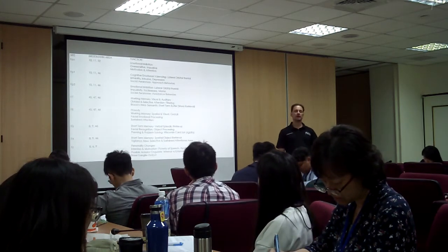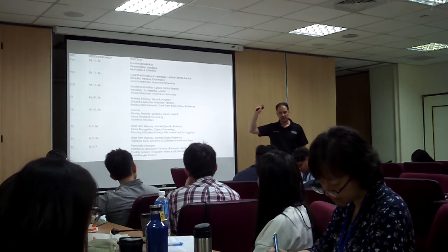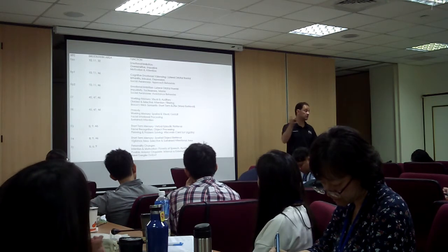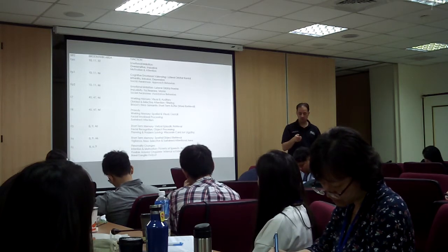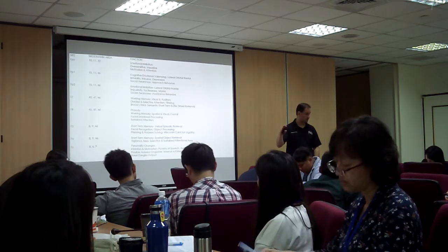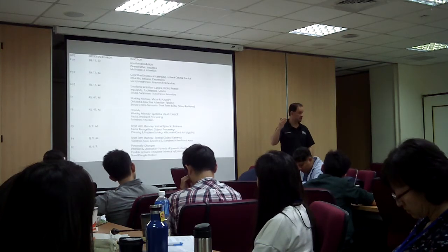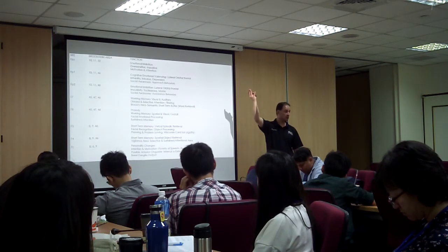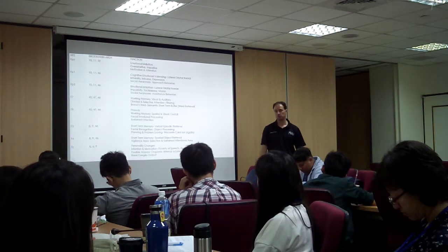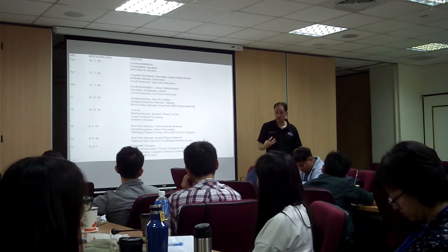So what you do is you close the eyes, you put the sensor there, and you inhibit anything that's fast, beta, high beta, and you inhibit the delta too because you don't want it to make too much delta at the moment. And then you just don't reward anything, it's just suppress it. And you use relaxation music, relaxing music. So what you do is you set up an inhibit for the fast brainwave activity. So if the fast brainwave activity goes up, you can either stop the music or you can set up a tone, whichever way you feel better about it. Okay. Some people don't like the tone, they get too anxious, so I just stop the music.